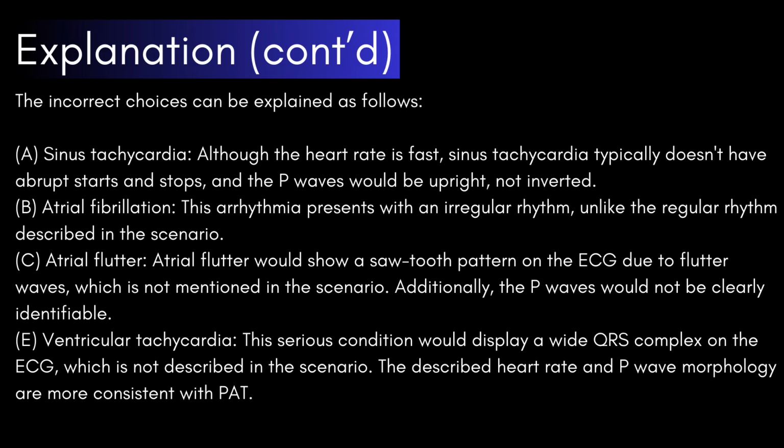E. Ventricular tachycardia. This serious condition would display a wide QRS complex on the ECG, which is not described in the scenario. The described heart rate and P-wave morphology are more consistent with PAT.